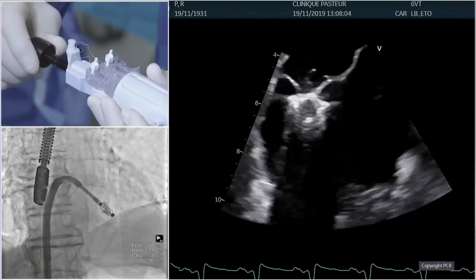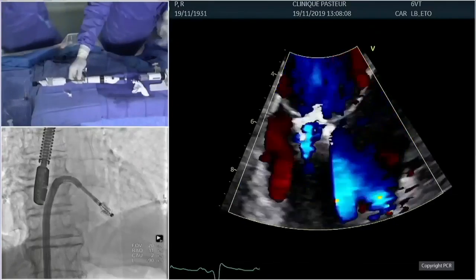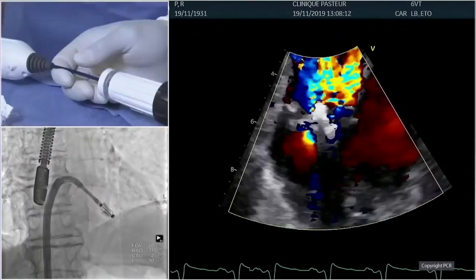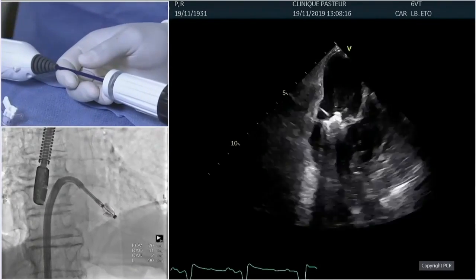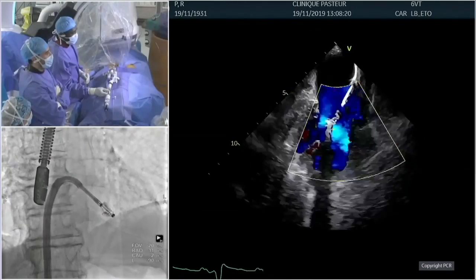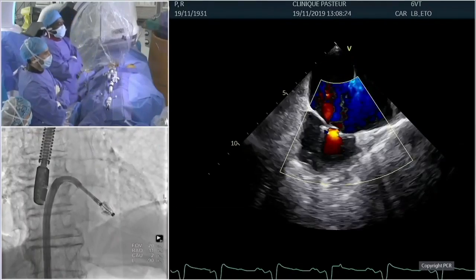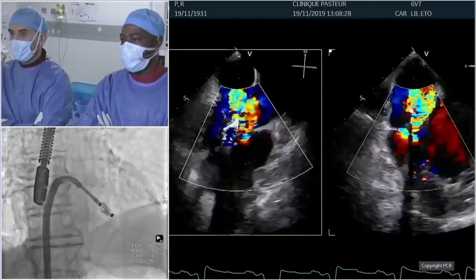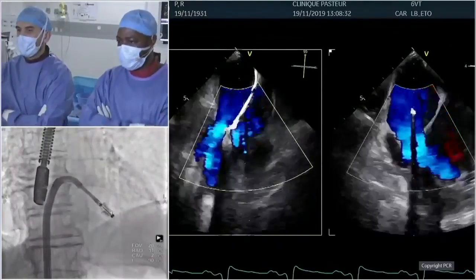And in color, please. On color, what do you see? It seems that we still have some jets. We have to determine if it's medial or lateral. I think we have to have a wider assessment, a wider view, maybe with a multiplanar view, in order to understand. Becky, what are you looking for at this stage? Yeah, the jet is a little medial, and the largest flail is a little lateral.